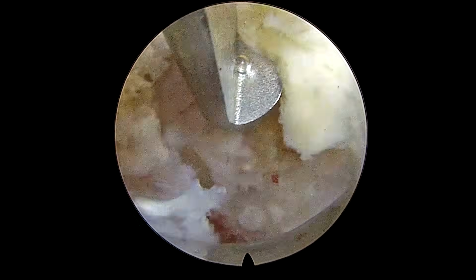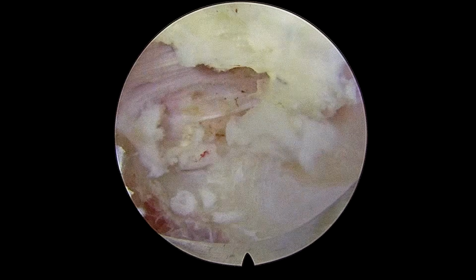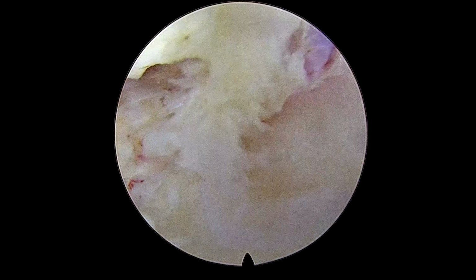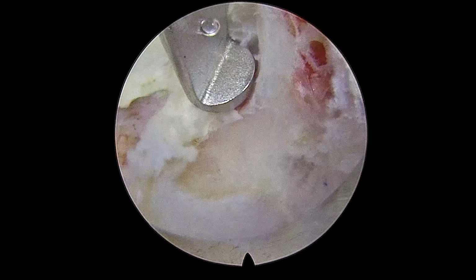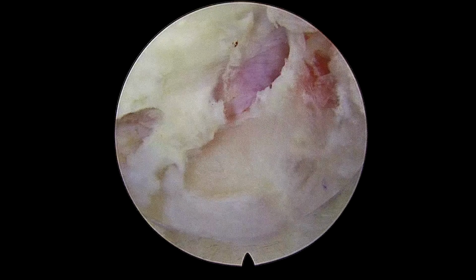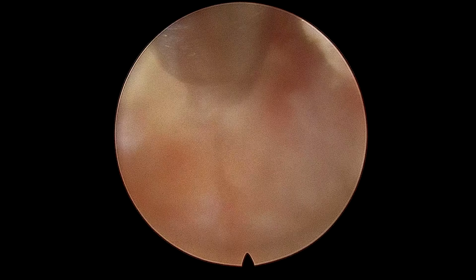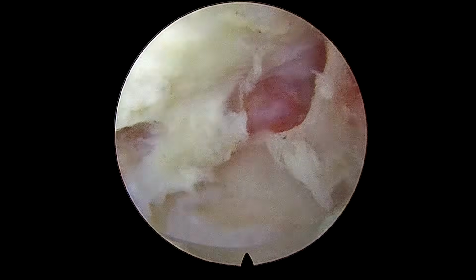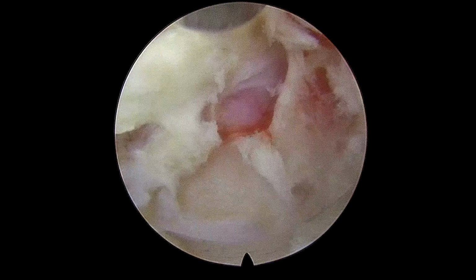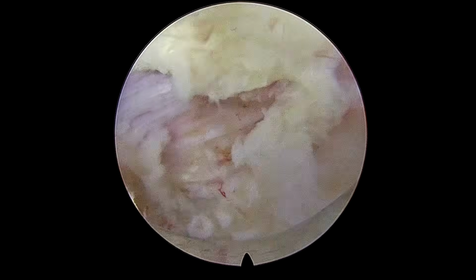Now we are using the Kerrison punch. This is the tube sheath punch with a very sharp margin. We will remove the ligamentum flavum, which is already freed from both the margins. And now we are removing the superior margin of the inferior lamina with the help of the tube sheath punch. Now it becomes very easy to remove the lamina because we have already thinned out the margins of the lamina with the help of the burr. So now I can easily remove the lamina.